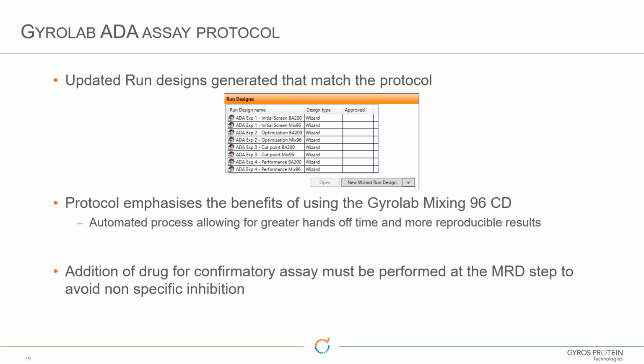Yeah. And then just a little note on the end that we found that for some ADA assays it's better to add the drug in the MRD diluent than it is in the master mix. But we do know that some customers prefer to add the drug as part of the master mix. So you should very much look at both if you want to add the drug at the master mix stage. Yep.